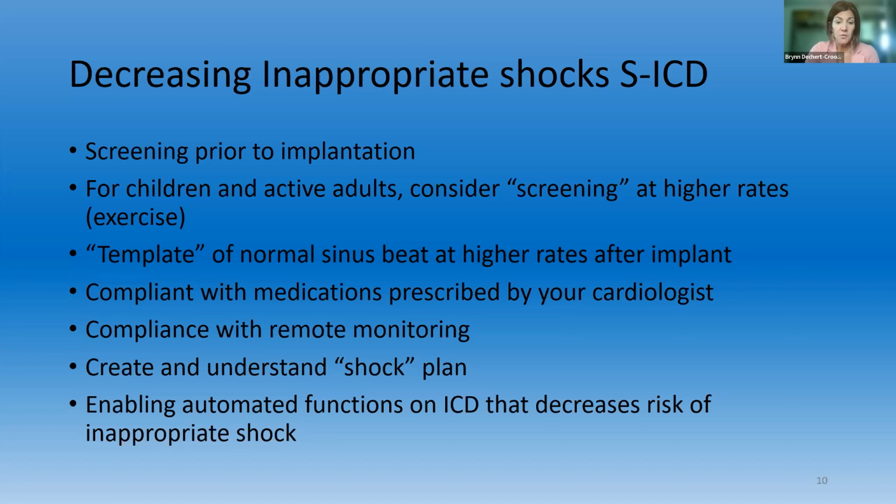There are also some features on both types of ICDs that can decrease the risk of inappropriate shock. So they're automated functions. Some of them are, like, lead integrity would be a word for it. In subcutaneous ICD, it's called SmartPass, and I'll talk about what that means. But these functions that are automated from the device are important to decrease this risk.